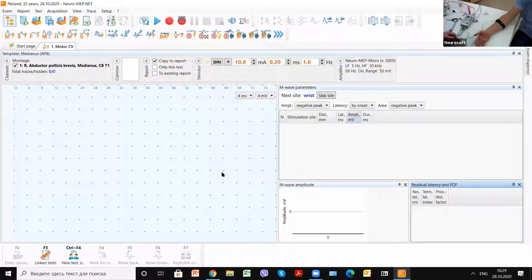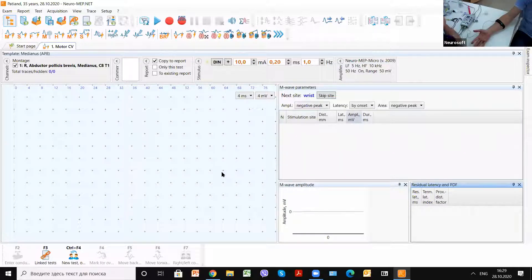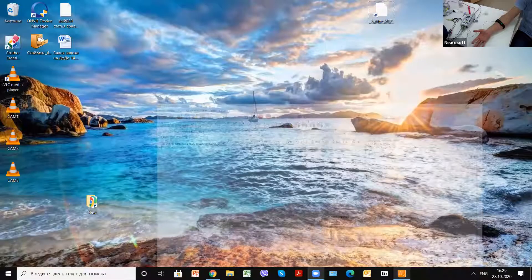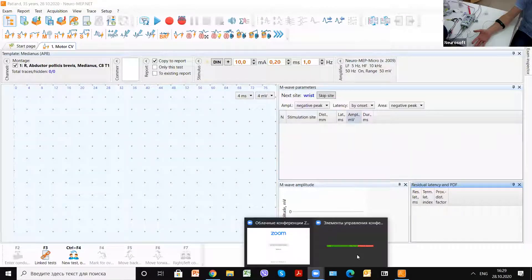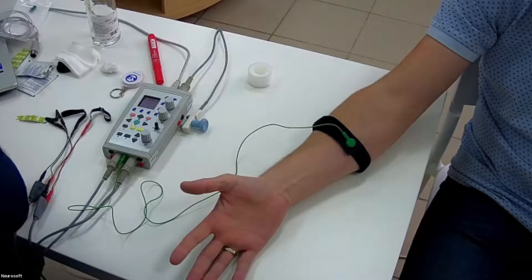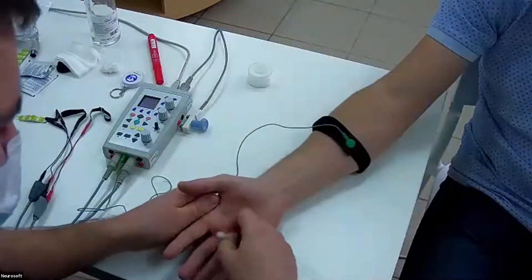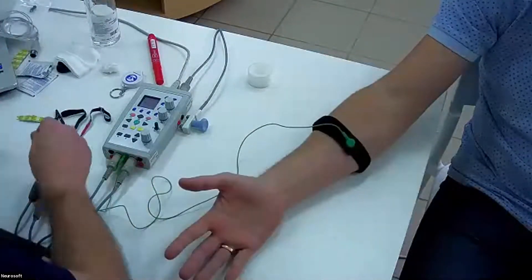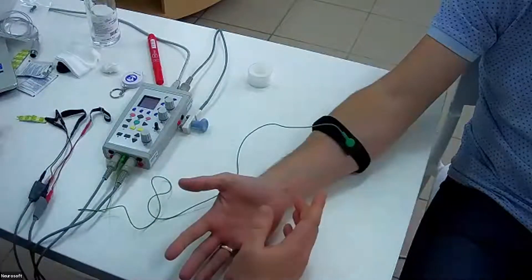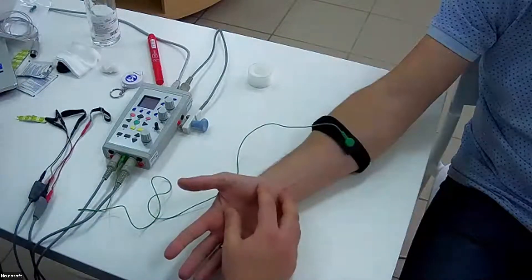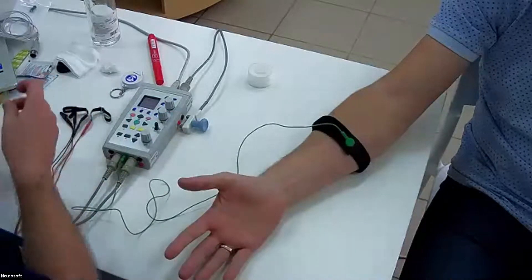We use alcohol to scrub the skin, which will decrease impedance. We apply it before placing the electrodes for the median nerve conduction studies.